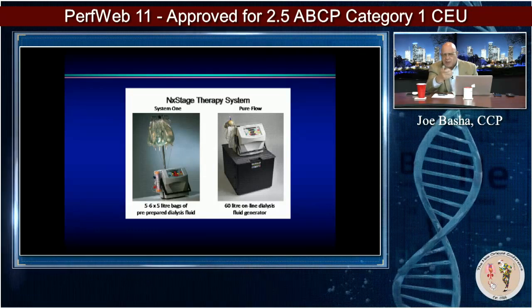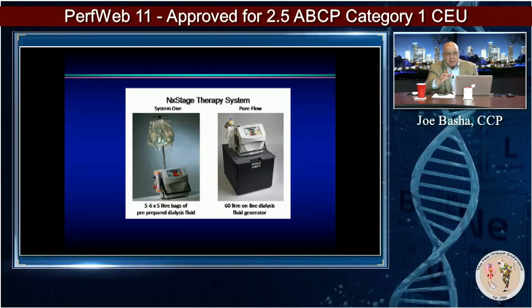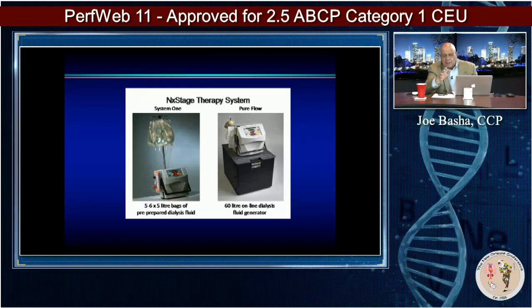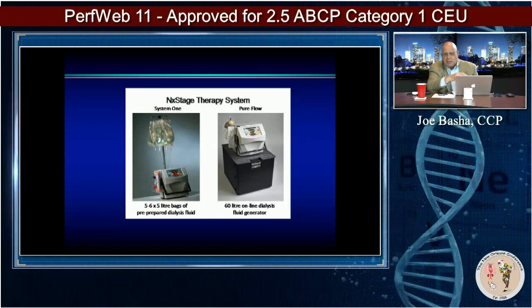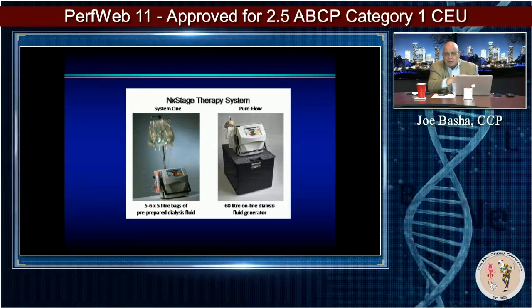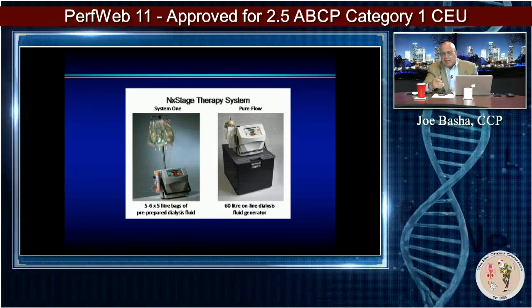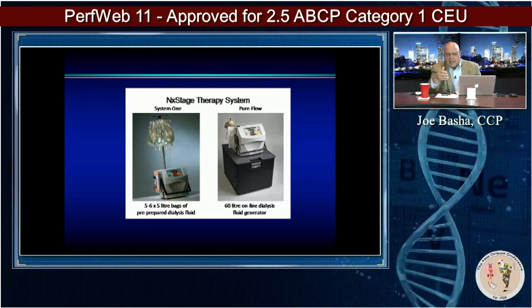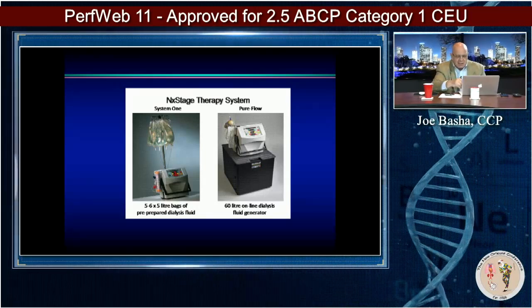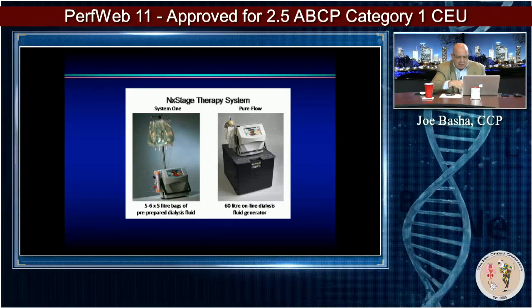However, you also have to consider, is it accurate? Now, I've had some people tell me, some nephrologists who are very, very strong CRRT users, that studies that they've done have shown that the volumetric was equal to and maybe even more accurate than the gravimetric, but I'm not really sure about that. Regardless, I wanted to point out that there are different technologies, not one technology exists, and each of them has advantages and disadvantages. You have to decide what's going to be best for you.